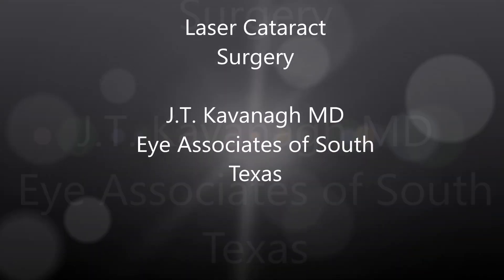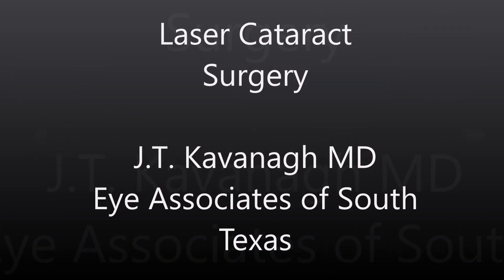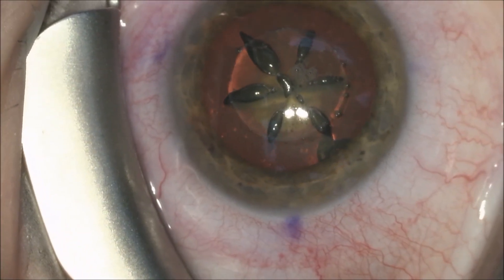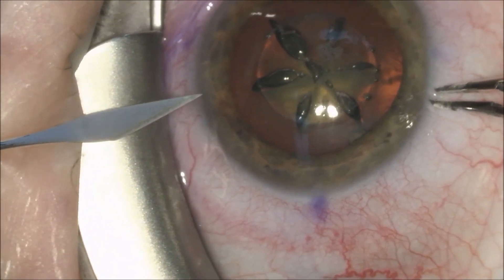This is Dr. Kavanagh of Eye Associates of South Texas. I'm going to show you a laser cataract surgery. This is a patient who's had the LensX laser. You can see that his capsulotomy has been completed and the nucleus has been fragmented.